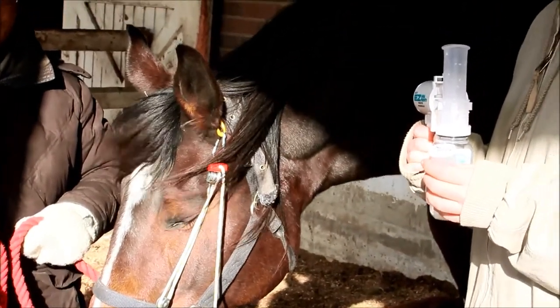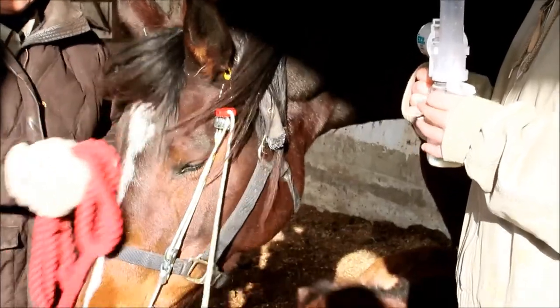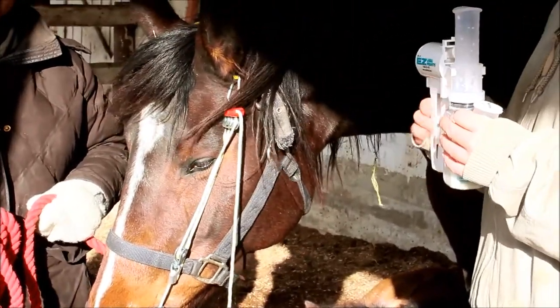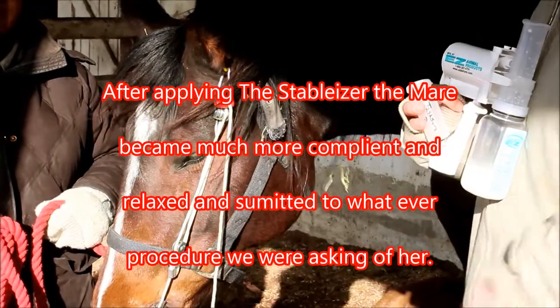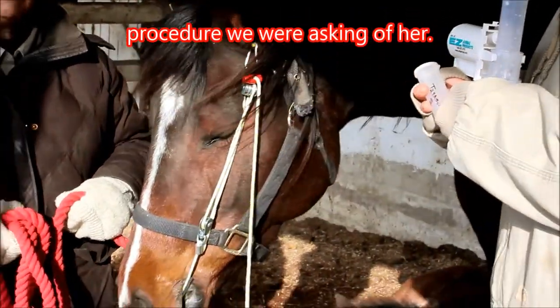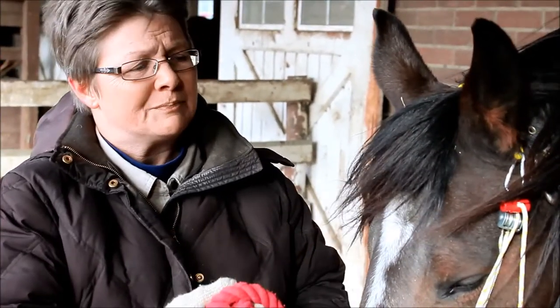It kept her from kicking. That's absolutely correct, and as you know this mare started kicking when we started out. She's not — that's the least of her problems right now — and she's just very relaxed, she's in la-la land. So the stabilizer has done its job there, and like I said, there should be nobody without this thing, because many times you're working alone, you don't need somebody else, or you can hook them up and go do your job. Yeah, and we have a lot of students — four students that are working on the project — and we require two to come out at a time, but sometimes you almost need three without the stabilizer, because this mare in particular would kick.